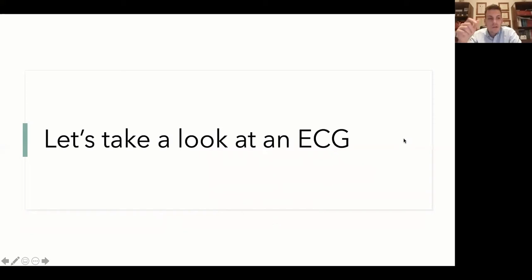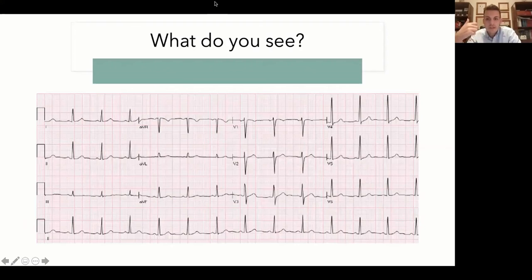Now, for the younger students, let's take a look at an ECG, and I'd like someone to tell me what they see here. Do they see anything pathological? Keep in mind, we need to see the 10 rules, and as you can see here in the AVR part, you can see the waves are negative, but that is not pathological. This can occur because it's the lead AVR.